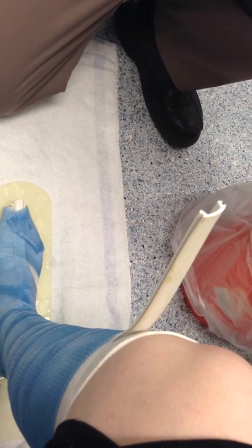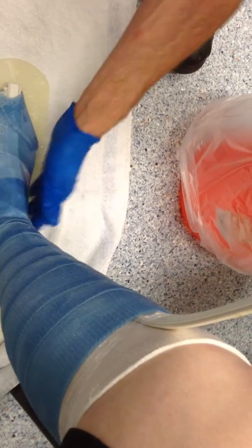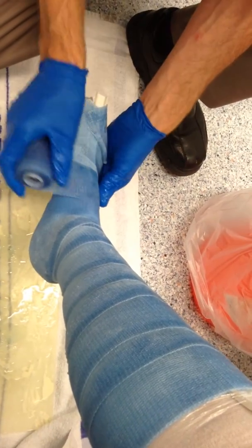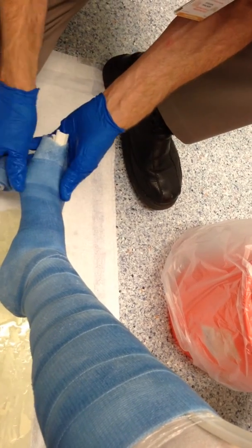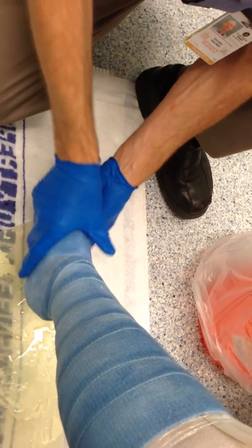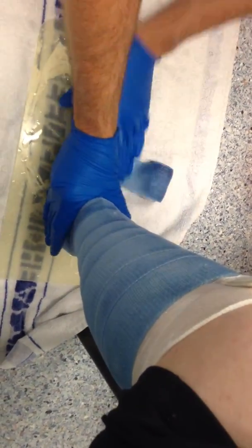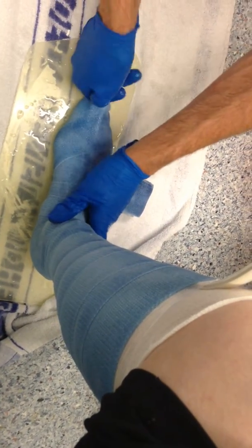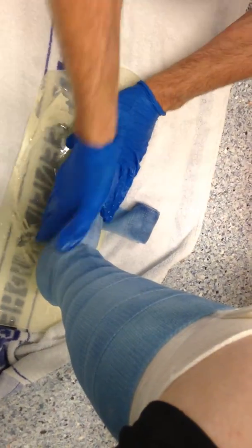I'm still just kind of sussing out the sizes that you need — a slightly thicker one. Let's get that one around there. Do you want me to lift the foot again? Yeah, lift up again — I'll just catch that little part, just around there, so we've got everything there. We've got it all there. I'm just going to get a quick rub around, just make sure that we're right. So we want to go back just a little bit further. You might feel that pinching just a little bit. Just those angles.